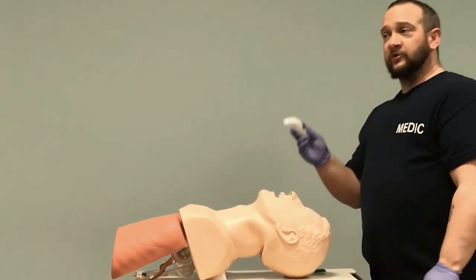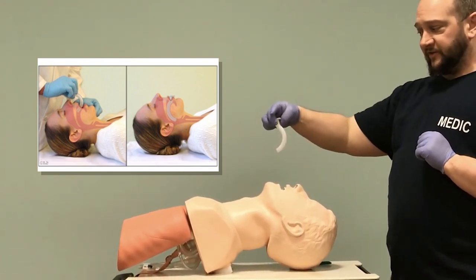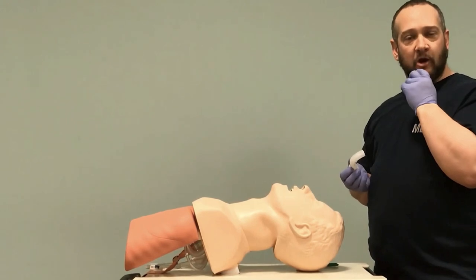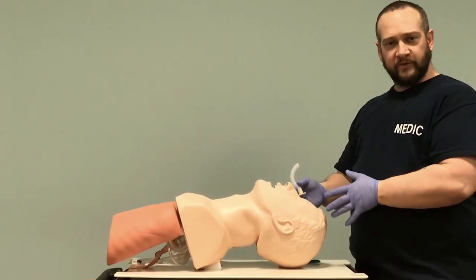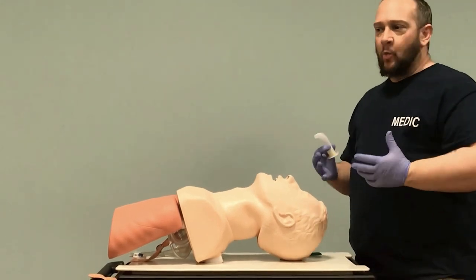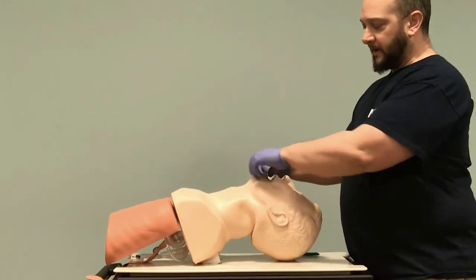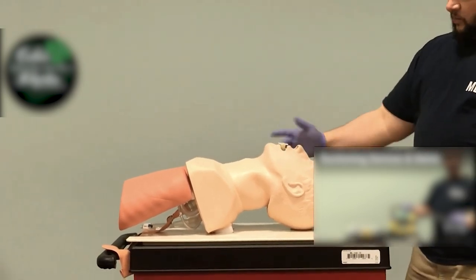There are two insertion angles. A lot of literature says to come in at 180 degrees — starting with the device facing the hard palate (the roof of the mouth) and rotating it completely until it sits over the tongue. We teach coming in at 90 degrees instead, because starting at the top risks nicking the hard palate. The mouth is very vascular, so tissue damage or bleeding means we're back to suctioning. Both techniques are appropriate — practice in the lab to find what's comfortable. With a head-tilt chin-lift, bite block, and tongue-jaw lift in place, come in at 90 degrees, rotate, and the device sits flush against the patient's lips.